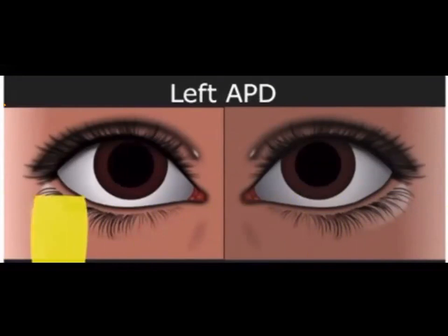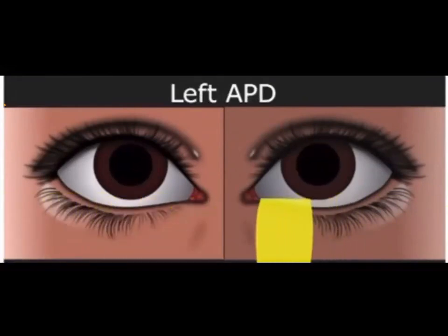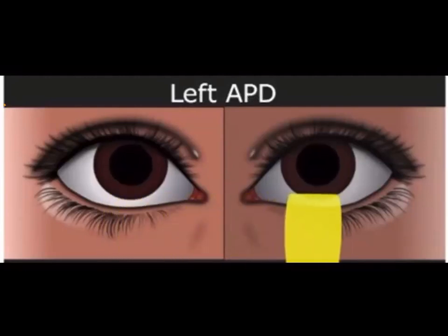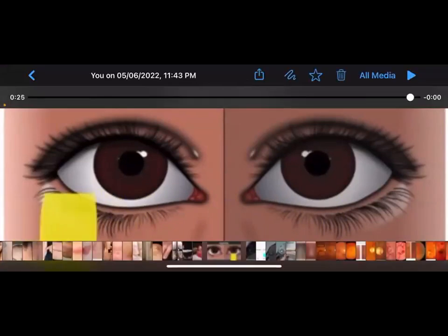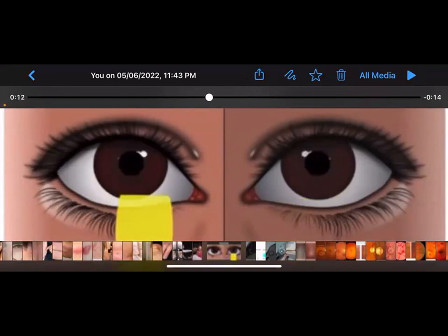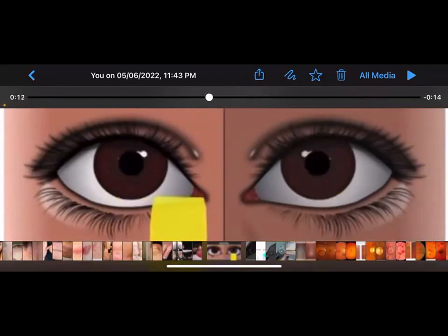But in afferent pupillary defect, see? Constriction, right? No constriction. Constrict. Dilation. Is it clear? I will repeat again. You expect whenever the light is on the pupil, it will constrict. If the pupil dilates, this is afferent pupillary defect. This is optic atrophy, okay?